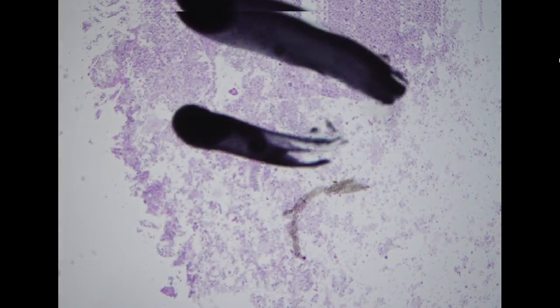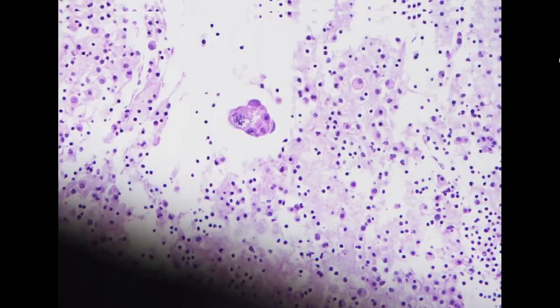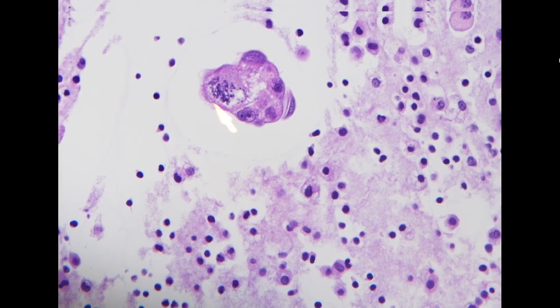For the cell block preparation, it also shows similar features with fewer tumor cells. But here you can still appreciate that these clusters show an artificial cleft around the tumor cluster, and here we do see very bizarre mitosis. So this is positive for adenocarcinoma.